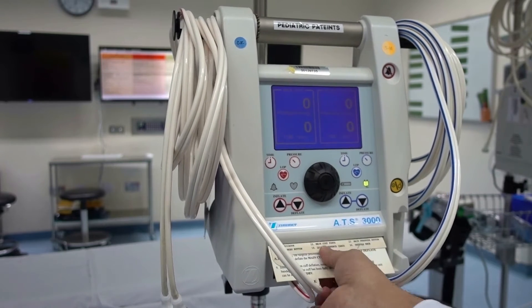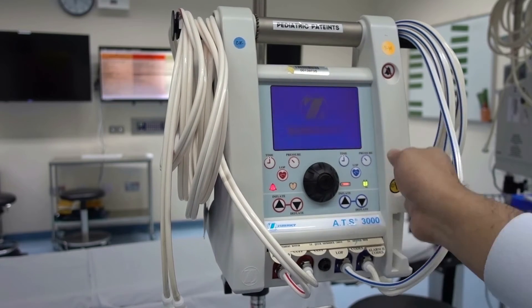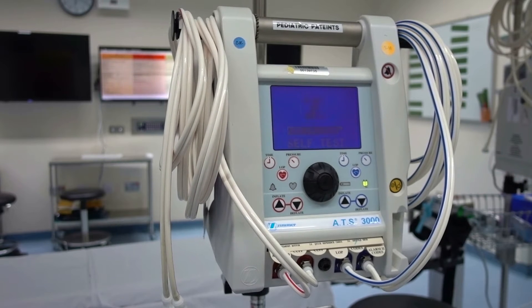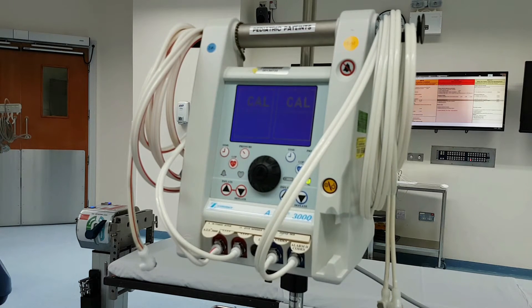Below these controls are the unit pull-out information guides. By pressing the on/standby button for two seconds, the unit turns on or is set to standby. Once it turns on, the unit will do a self-test on its hardware and software while at the same time calibrating the whole unit.